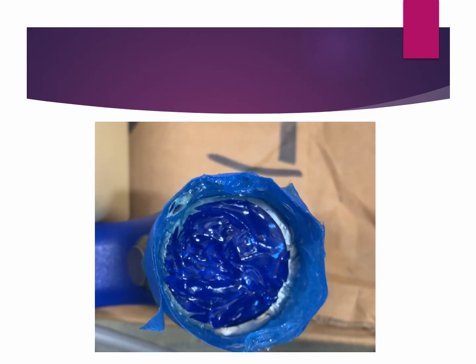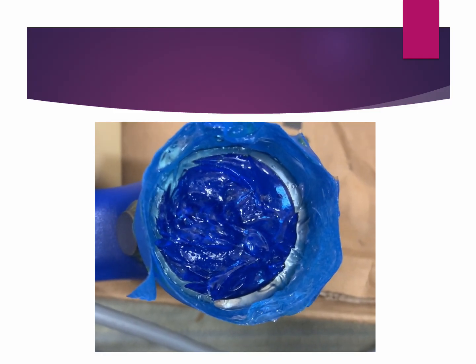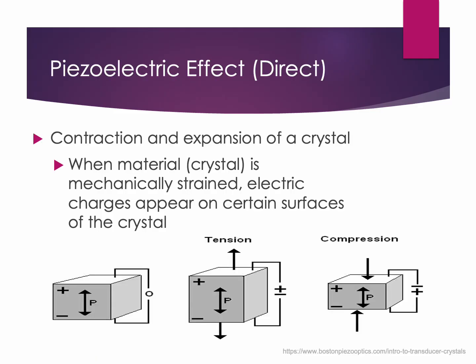This is a video of what happens to the ultrasound gel when you turn the ultrasound unit on. You can see the vibration of the gel as the sound waves pass through it, much like the previous video of the speaker. Just for your information, there is a principle called the direct piezoelectric effect. The direct piezoelectric effect is when energy is produced by a crystal being mechanically stressed. This principle is important because it explains both how ultrasound is generated and how tissues, like bone, can respond to mechanical forces.